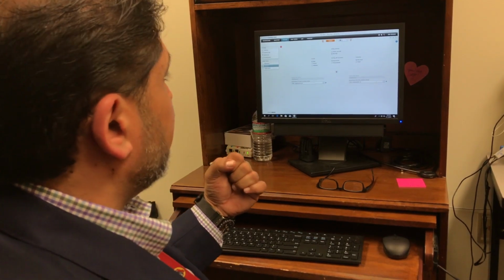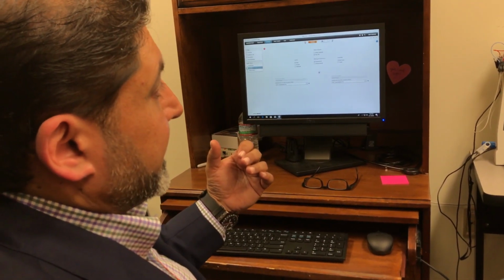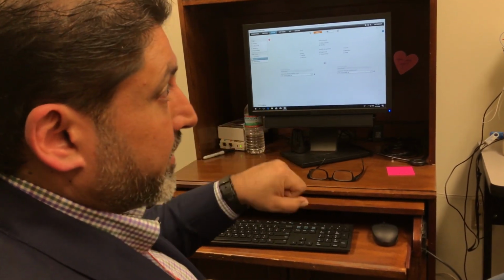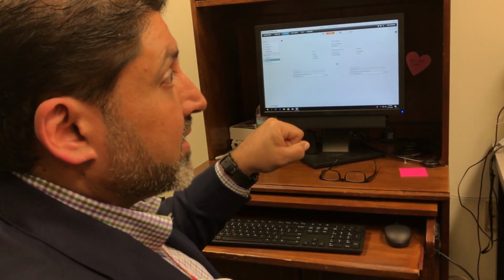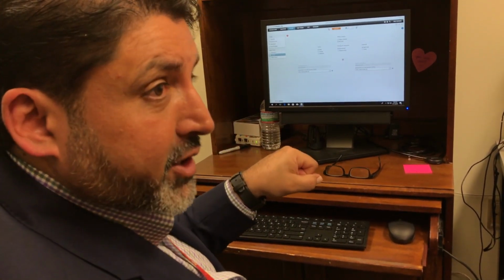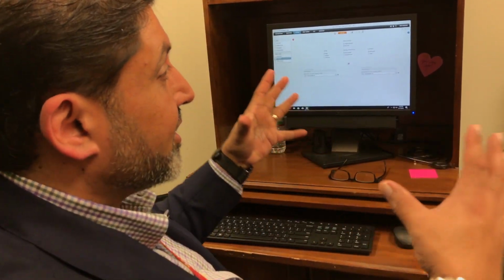Like if we take some of the Spanish, we take some of the Asian languages, right? It's more intonation based. Intonation causes rises and drops in what? Intensity. We don't want the hearing aid to kick in and out of compression. So what does it do to your compression ratio? Your compression release time. It makes it longer.